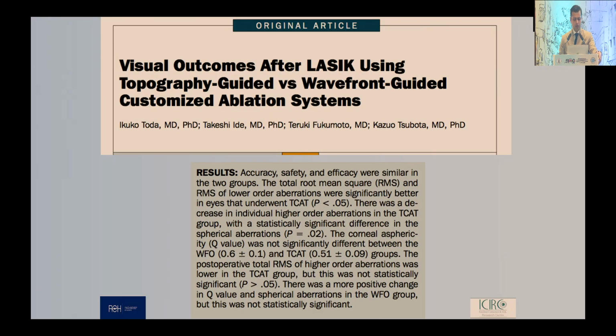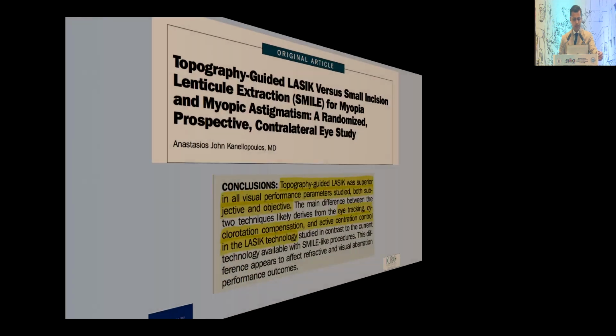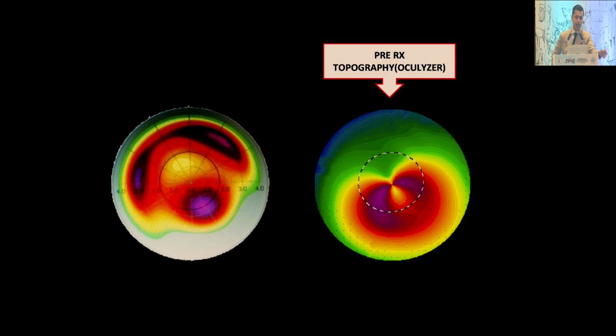There are many studies that have proven that topo-guided treatment gives you better visual outcomes. And I'm not going to read this in the interest of time and to save something for Dr. Bhaskar to talk about. Just going to finish off saying that if you look at topo-guided treatment, this is an age where everything is changing. The whole world of refractive surgery is changing into lenticule-based surgeries. But what we need to understand is the primary reason we are doing a surgery for patients is for vision. And when it comes to vision, the crisper you can treat, the better the patient's vision is. So in my hands, topo-guided treatment or Contoura vision works favorably, and almost all patients are very happy and comfortable within 24 hours of surgery, and most patients see more than one line at the end of the day. Thank you.